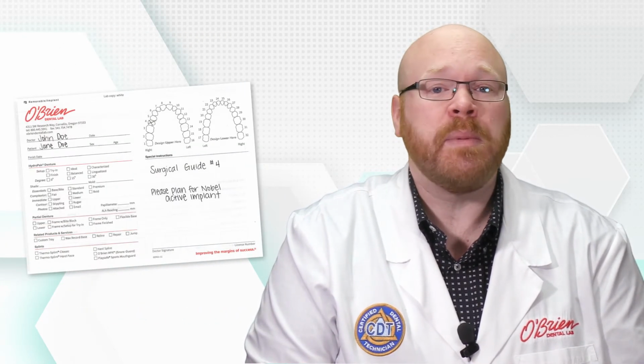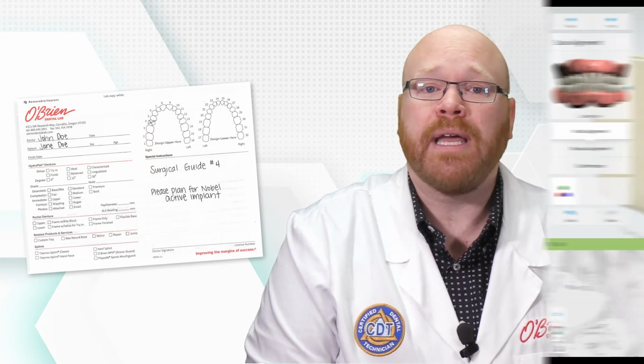Third, we need a prescription from you that lets us know which positions the implants will be placed, as well as your preferred implant brand.